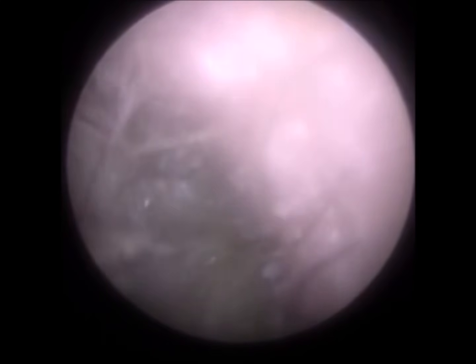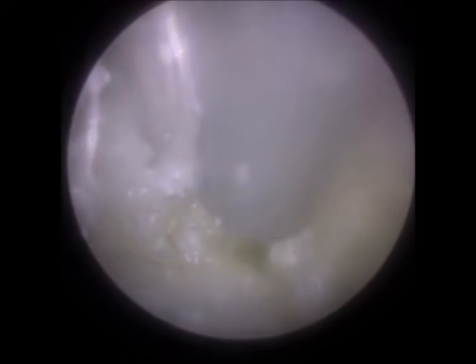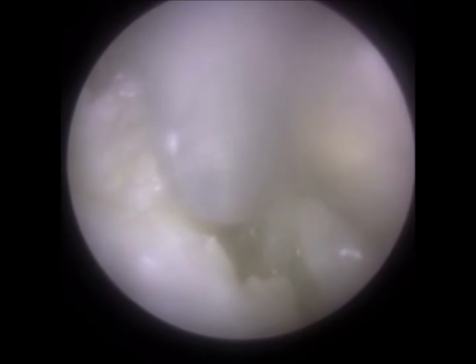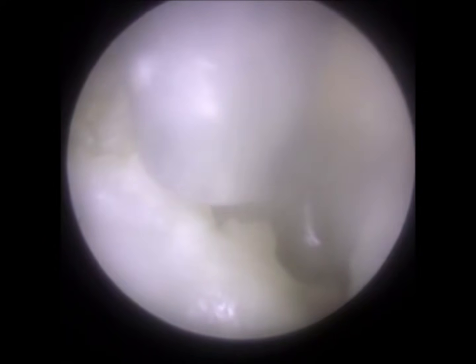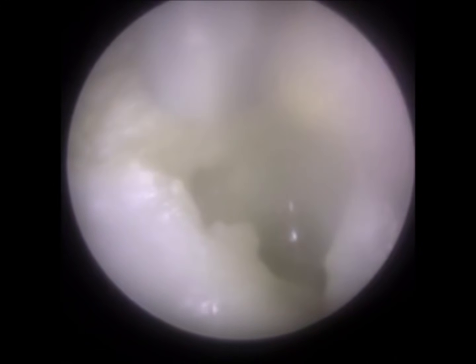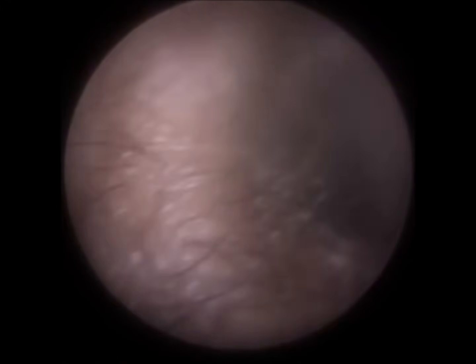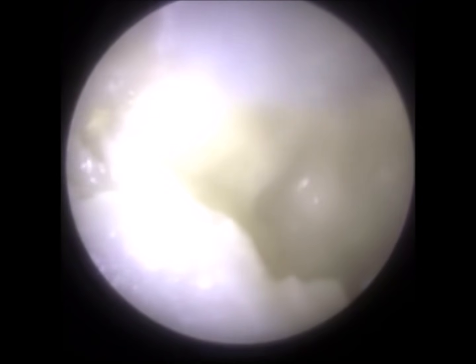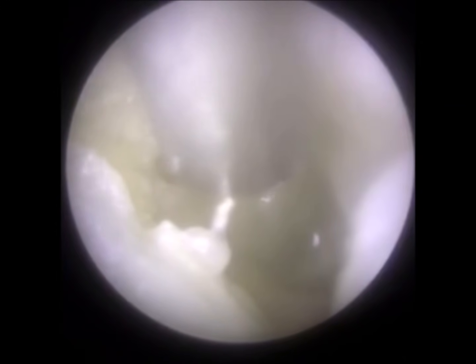So I'm initially just trying to vacuum all this discharge, what we call otorrhoea, from the ear canal. And once I've removed the bulk of this discharge in front of you, and it's also a lot of dead keratin, a lot of dead skin, you're able to visualize the eardrum. And this patient, as per the title of the video, requires urgent referral to ENT. In reality, this infection's been in his ear for a lot longer than 2 months, and it's caused severe erosion of his ear canal, which we'll talk about a bit later.